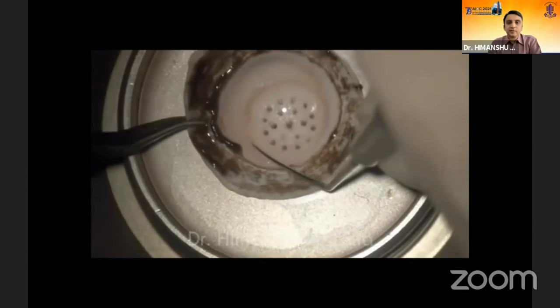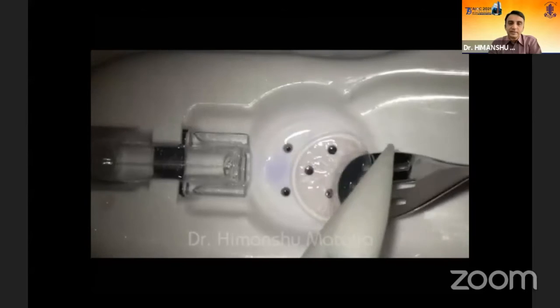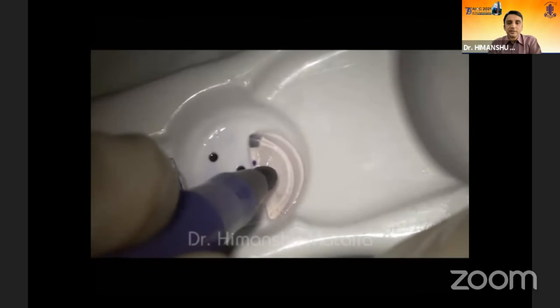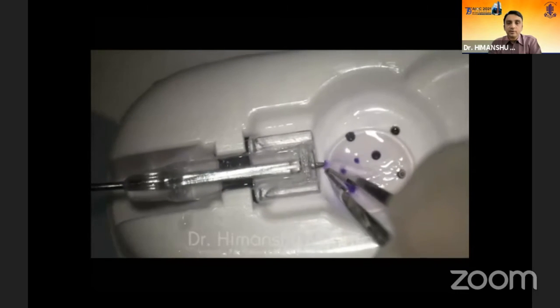After inserting the ACIOL, now this case was dissected on femtosecond laser. So I'm dissecting that tissue, which is part dissected on femtosecond laser. This is the Tan EndoGlide, and I'm mounting the tissue as it's dissected on the femtosecond laser. The marking had to be done later on.